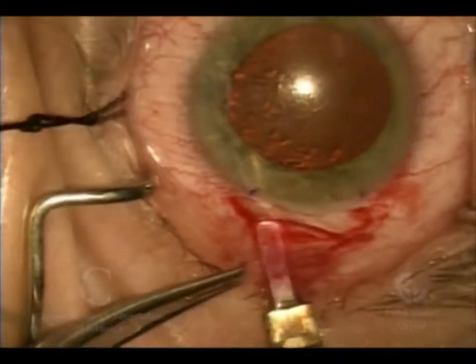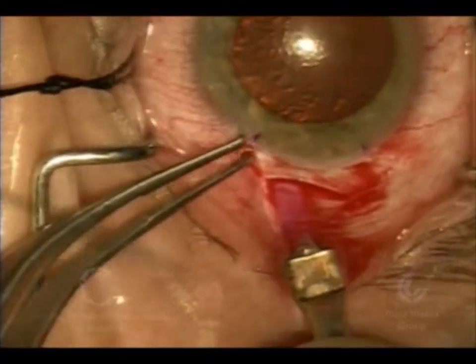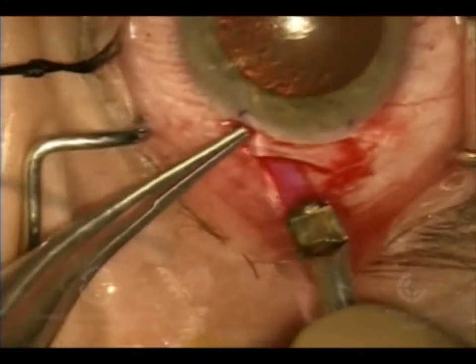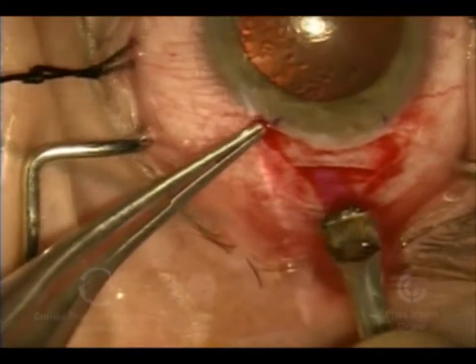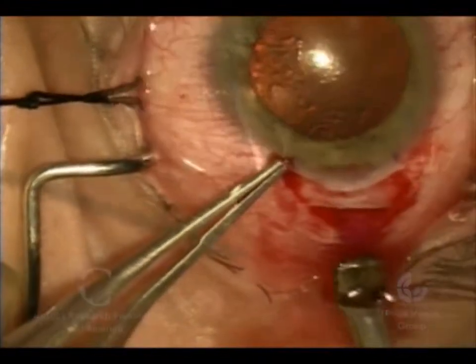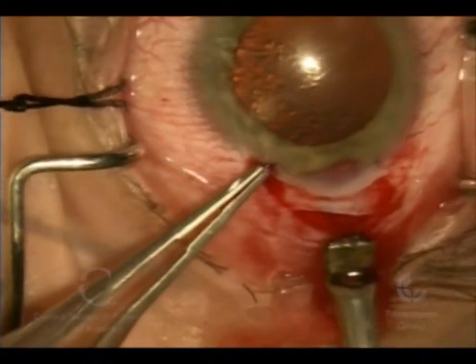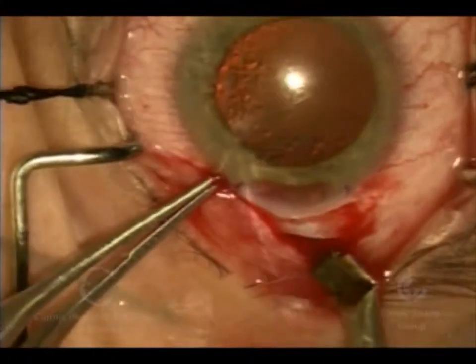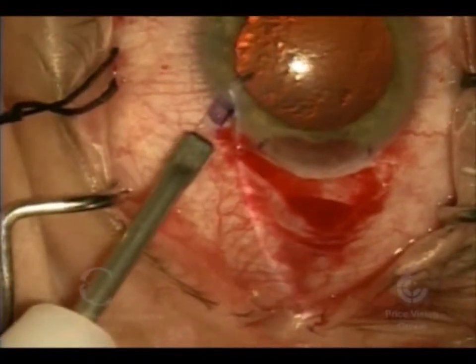Now we're going to do a scleral tunnel here, which is a little bit short because we're doing it combined with cataract surgery. I'll typically do a longer scleral tunnel if there's no cataract surgery involved. We made first a partial thickness incision perpendicular to the surface, and then at the base of that incision we're doing a lamellar dissection parallel to the surface, taking the dissection into clear cornea. Typically we'll make these incisions a little bit longer so they're totally self-sealing and we don't have to worry about placing any sutures, but when combined with cataract surgery we tend to make it a little bit shorter.